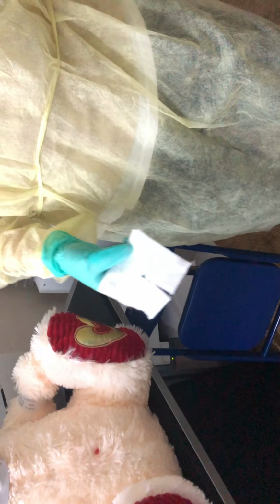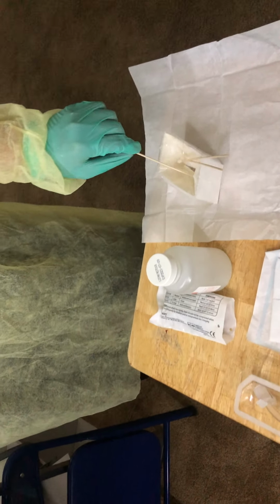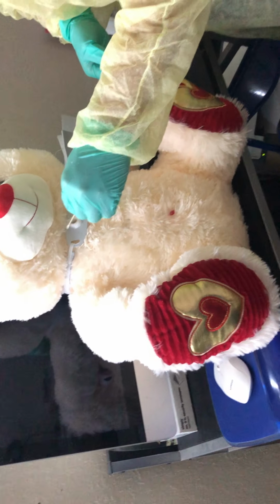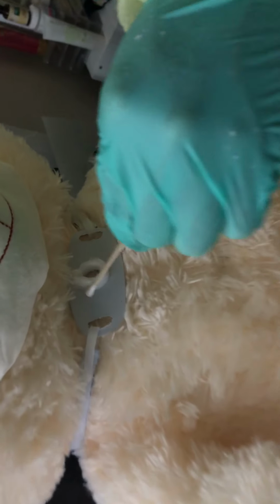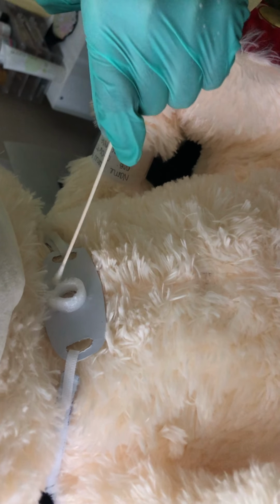And biohazard. At this moment, I'm going to pick a clean swab. I'm going to clean side, top, all the way to bottom. Clean the secretions. There we go. Away from my sterile field. Again, top. Take off all the secretions.